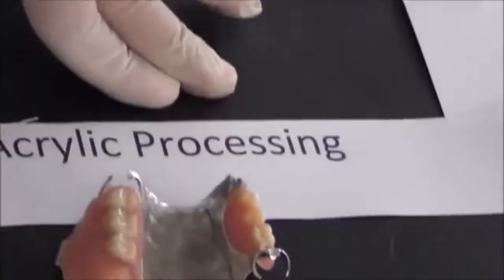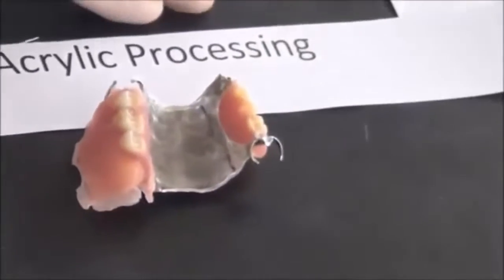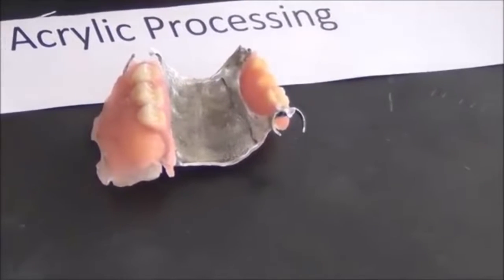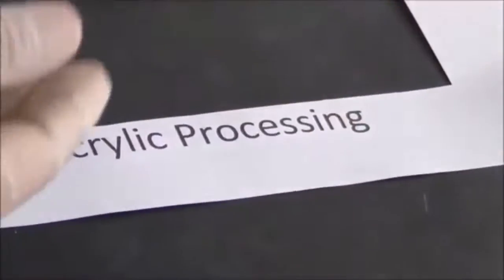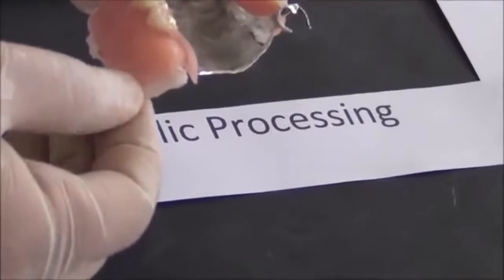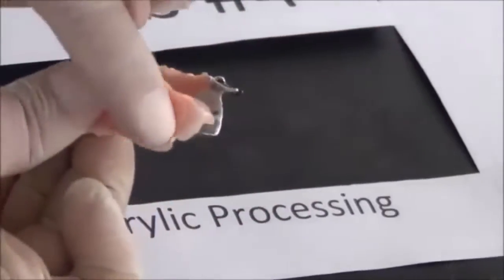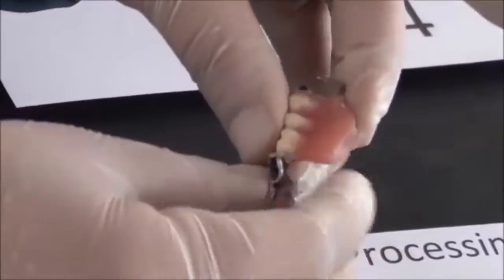The wax is replaced with acrylic using the same process you used in complete dentures, which is flasking, then dewaxing, then packing, and finishing of acrylic. After packing and curing the acrylic, once we take it out of the flask, after deflasking, we will find that the acrylic is rough. You will have some edges. These all should be finished.